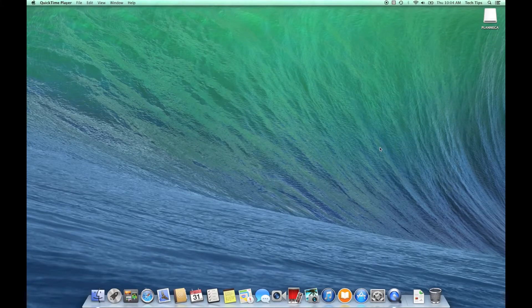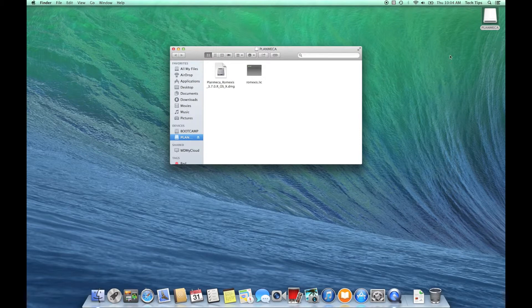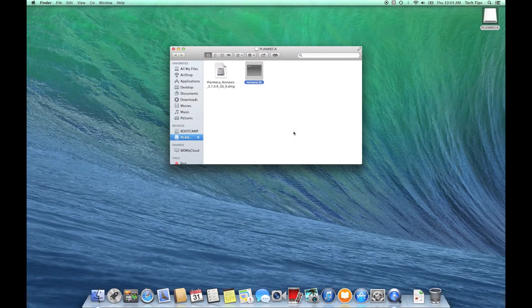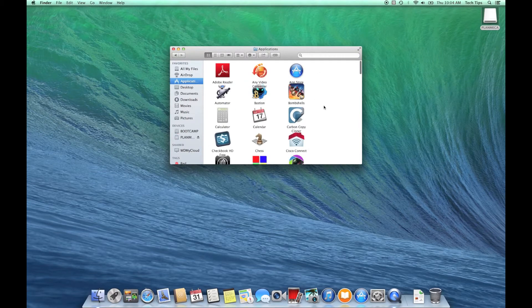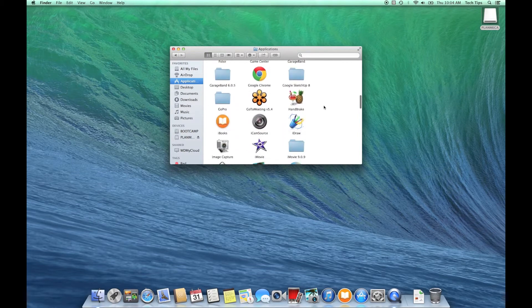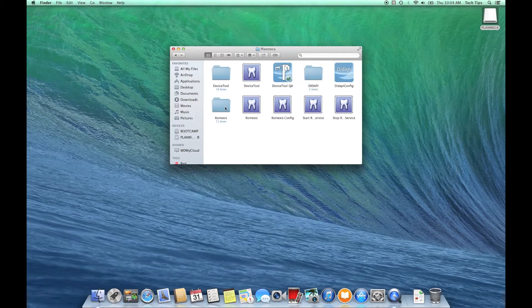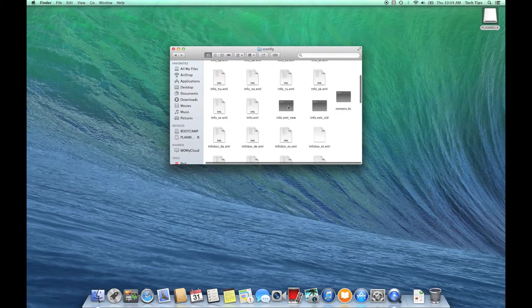Let's get started. Every Romexis disk set is going to be shipped with a license disk. I've already copied the license file to my thumb drive — it's a very small file. To install it, copy it and then go to your applications folder and paste it under the PlanMeka folder. Open that, go to Romexis, and then there's a folder called sconfig. Simply paste the license there — I already had one there, so I'll paste right over it and select replace. The license is installed — it's really that easy.